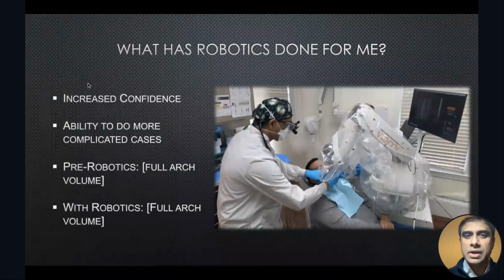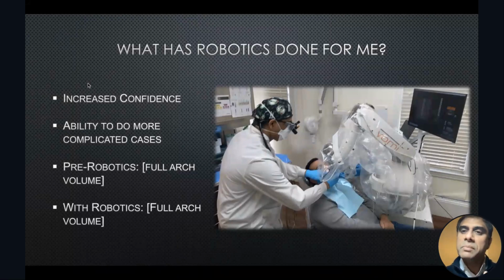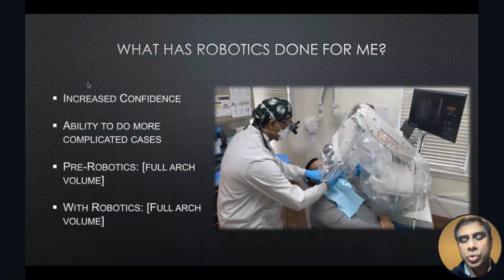I know the challenges are like, what if the prosthetic part does not fit into the implants that have been placed? But as I said, if there's not much deviation from the surgical protocol, then there should be a proper, quick, easy conversion of a prosthetic system into a full arch case. And all this really helped us go into those more complex categories of implant surgery.